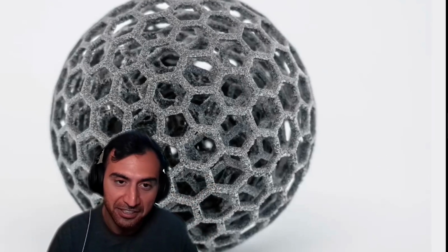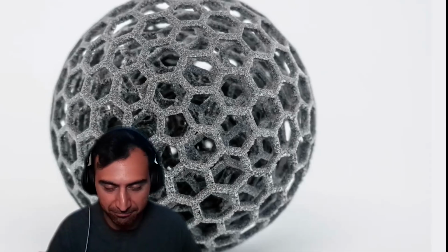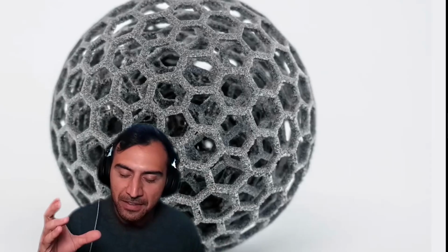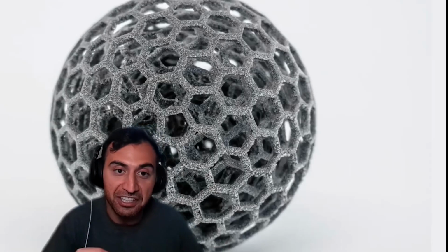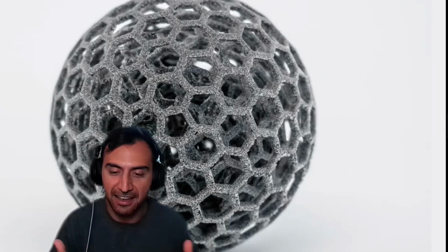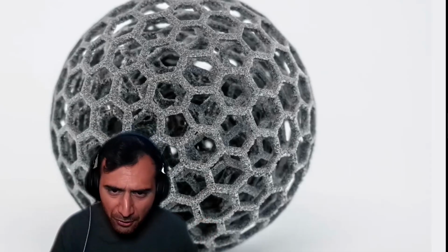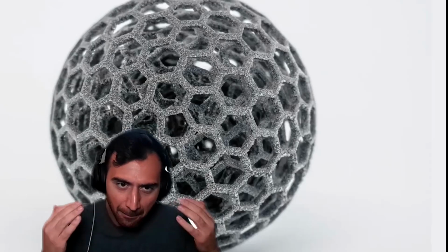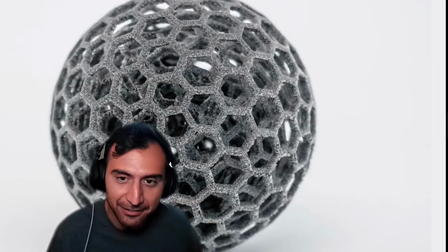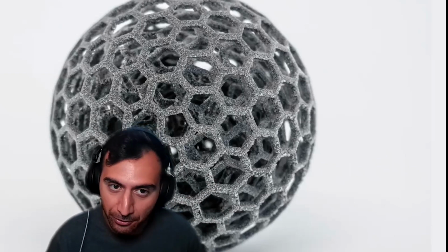But additive 3D printing is essentially making something from nothing. You basically have, in our world, a liquid pool of resin that we create into an object, which allows you to add things within the object, create complex objects that have intricate canals and formations to them. Whatever you can imagine at that point, you can design and create with additive 3D printing, and it's more efficient as far as waste of material as well.